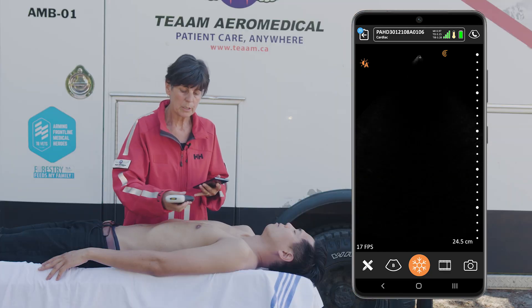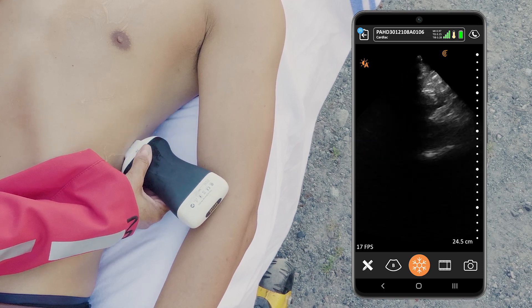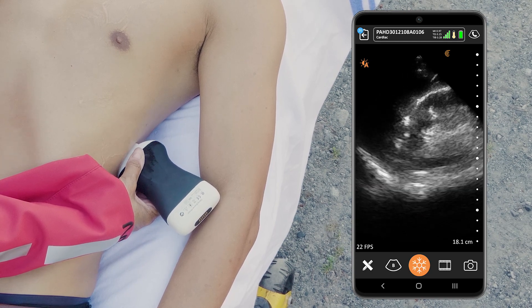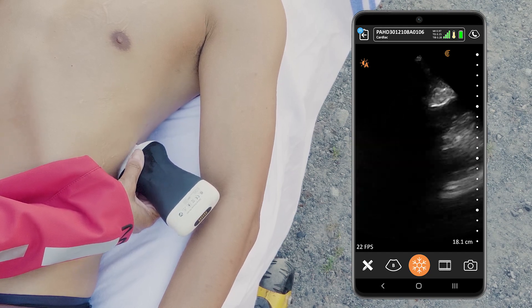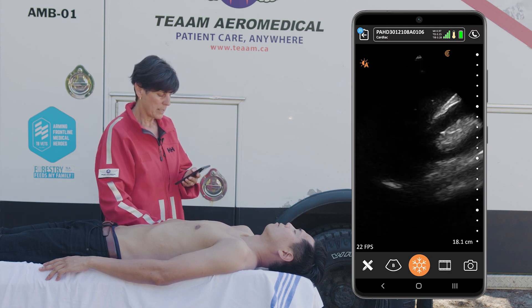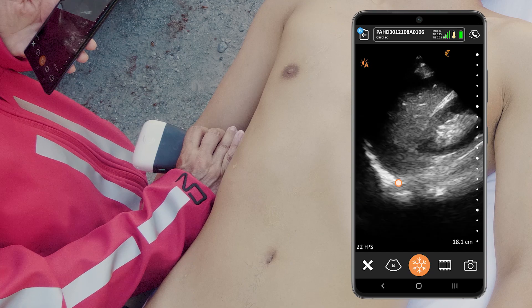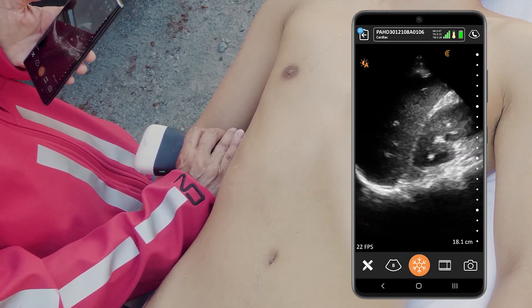This exam also includes looking for pleural fluid. I'm going to look at the left hemidiaphragm, which is the bright white line that we're seeing. Pleural fluid will be in the dependent portion here, so I'm just going to fan the scanner posteriorly. We'll do the same thing on the right, looking for pleural fluid on the right side — a little bit higher than our Morrison's pouch view — scanning the right hemidiaphragm anteriorly and posteriorly to look for any fluid in this area.